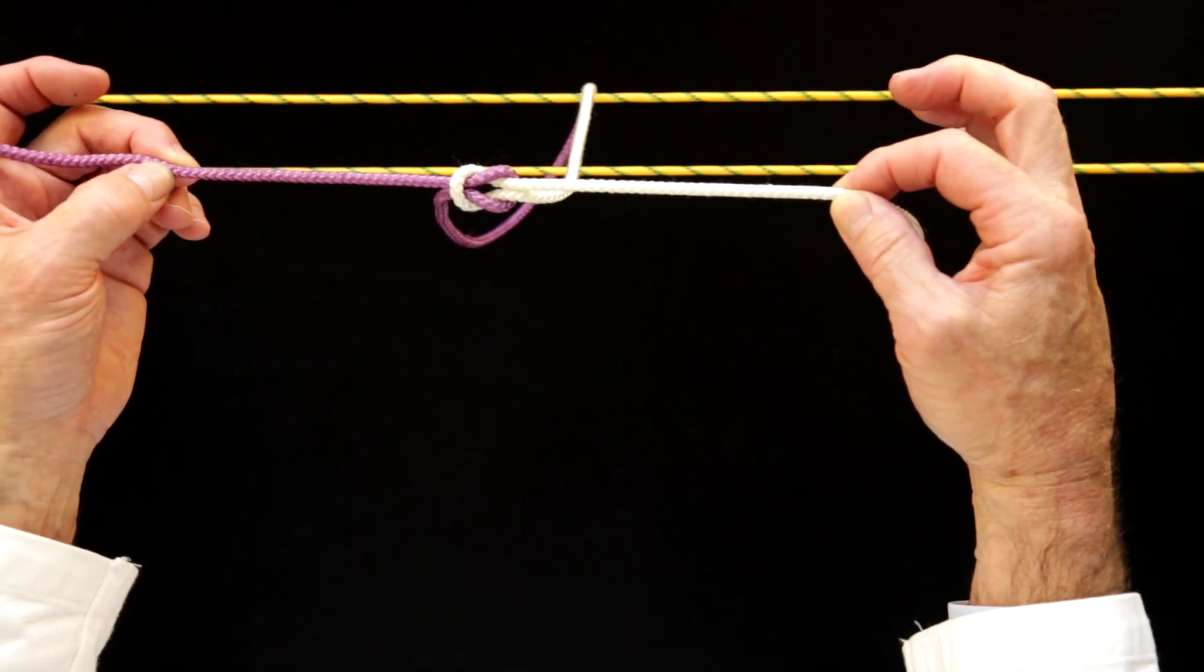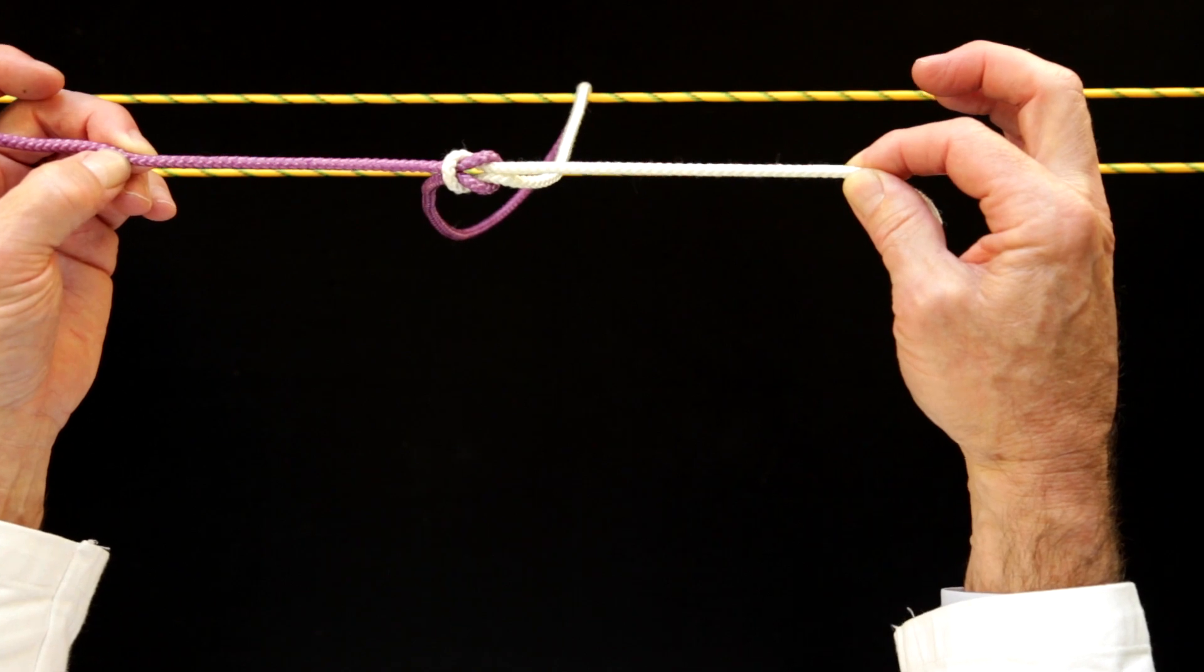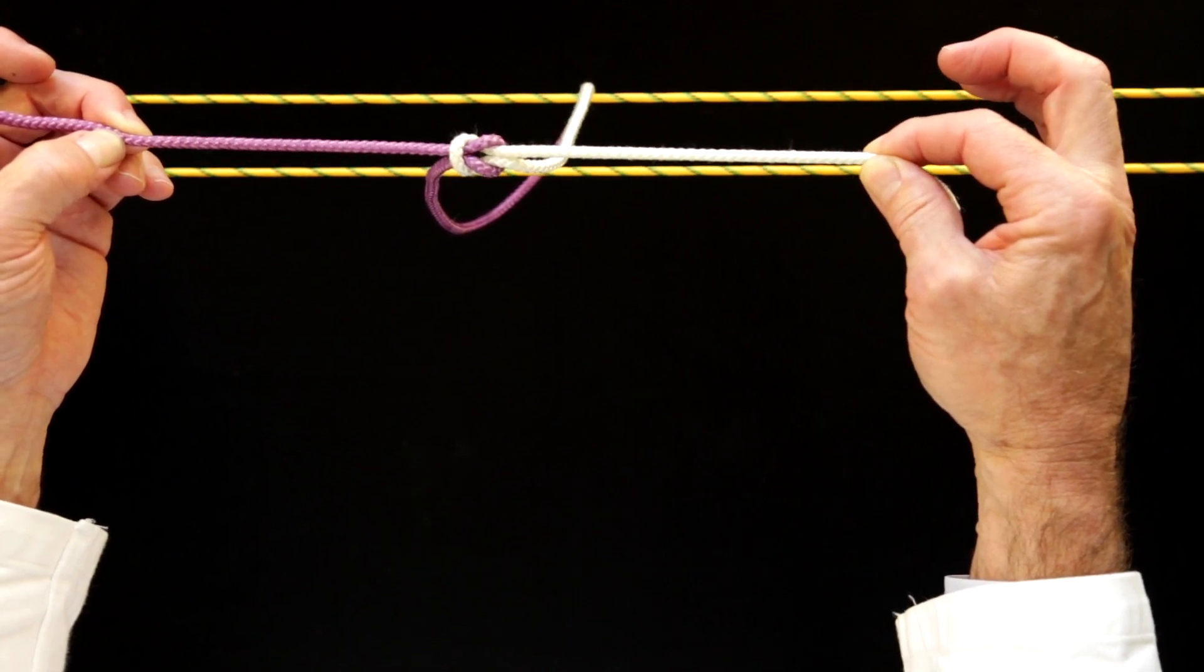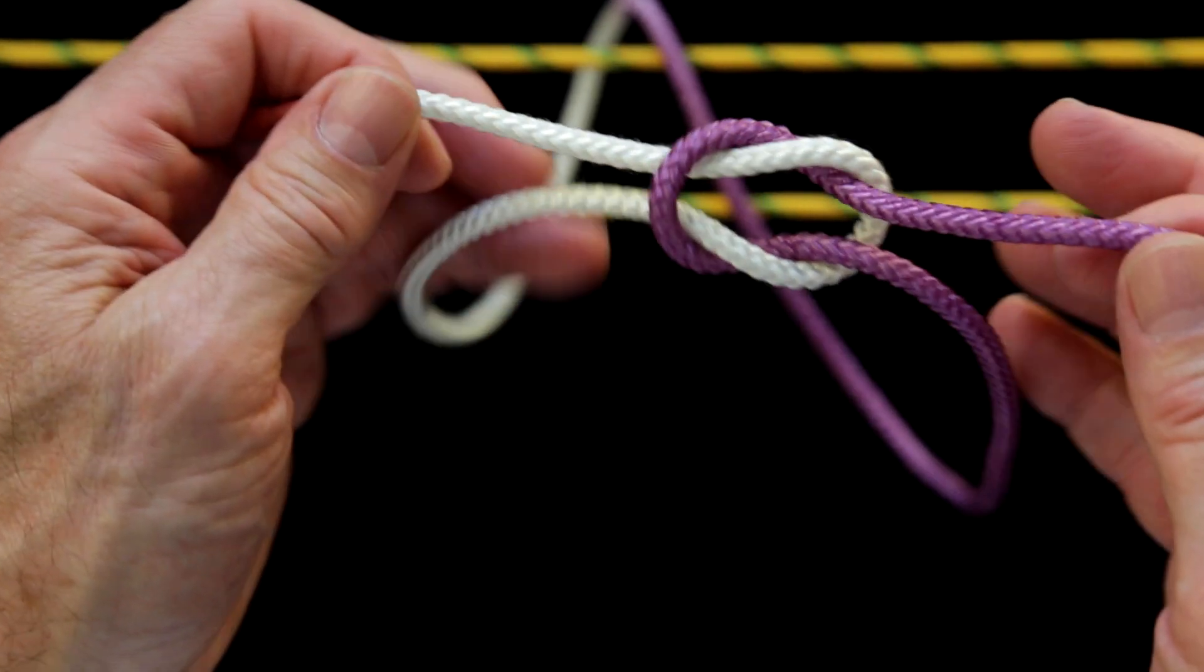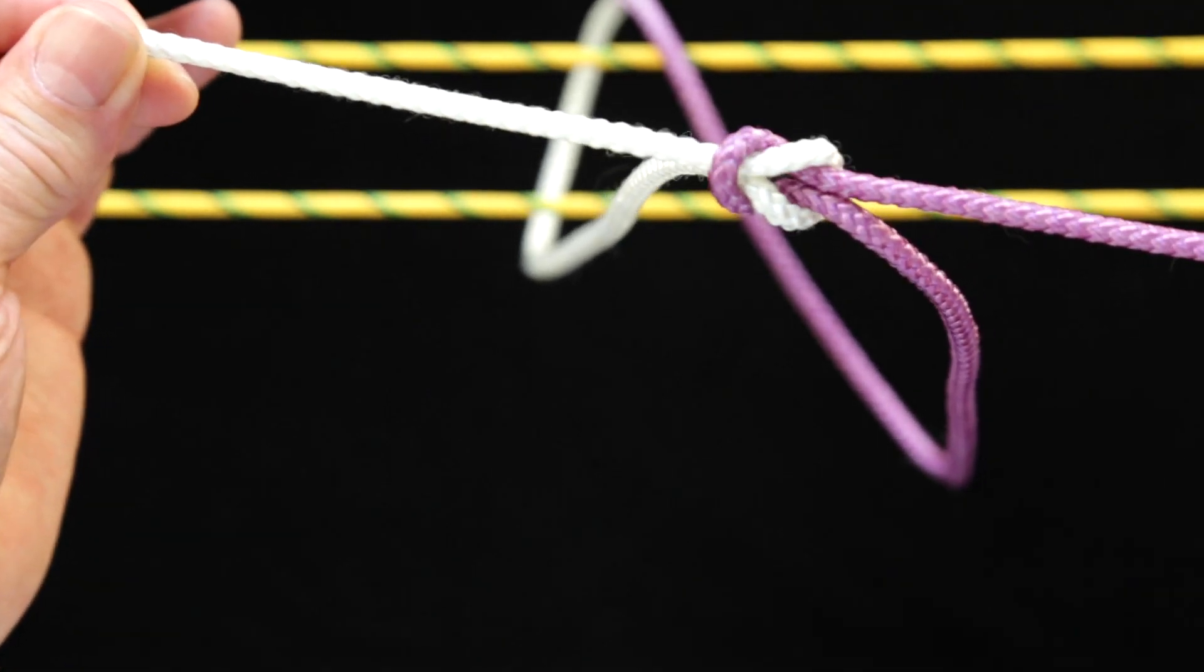You can see the two working ends moving away from each other. There is no movement of the two non-working ends which preserves the size of the loop formed by the non-working ends.